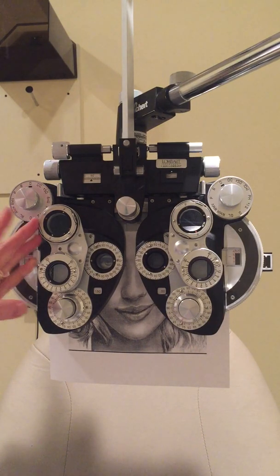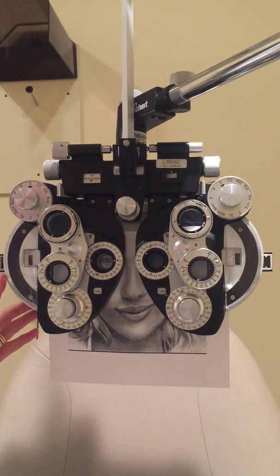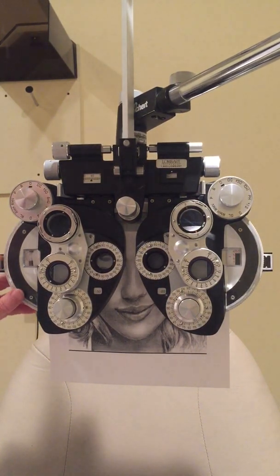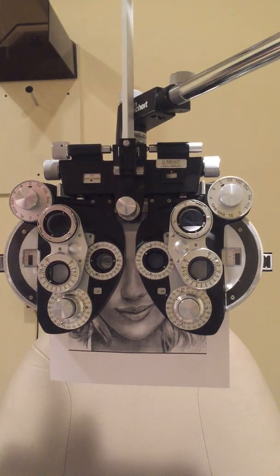She just read the 20/20 row, but maybe she's over-minused. I check by taking some minus away. With a 1 vs. 2 comparison, she prefers less minus — her glasses were a bit over-corrected. After the second comparison she's consistent, so I leave it there. Now that I have the gross sphere power done, I'm ready to refine with the JCC.